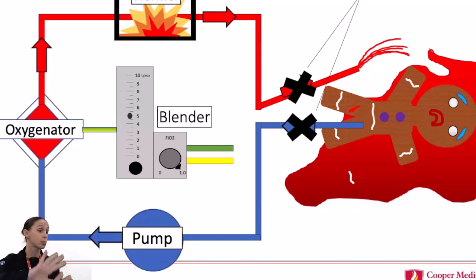The nurse was appropriately applying broad pressure to the neck, but what we really moved to, and forever since that day I've referred to John as the ECMO ninja, John had this patient clamped off ECMO, so clamp, and the power turned off, in seconds. And then if you clamp, or at least finger cap, in this case I just put my thumb over the end of it, we stopped losing blood additionally from this site. So now you've stopped the blood loss.